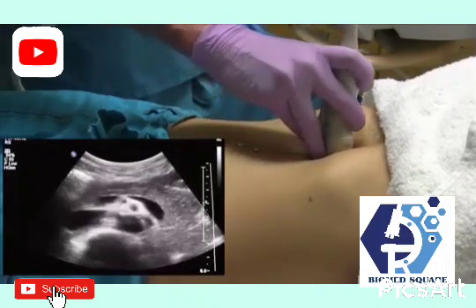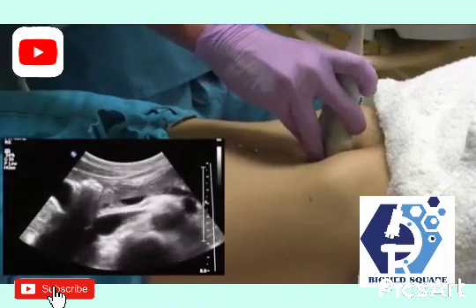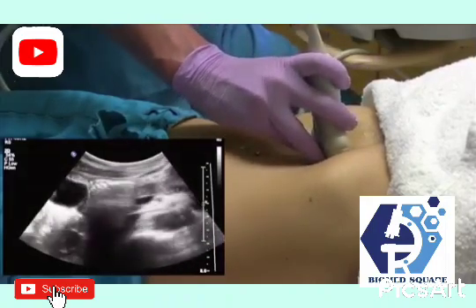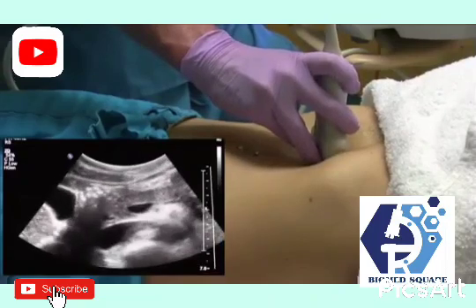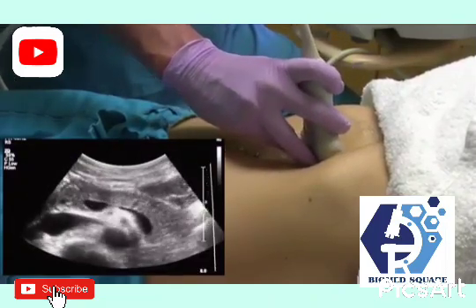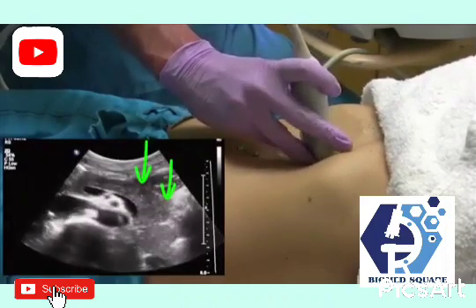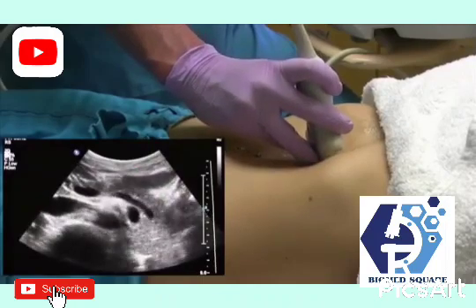And we'll also try to look at the head and uncinate process here, all the way down to the tail of the pancreas. Most patients, you probably won't be able to see the entire tail of the pancreas, just because it kind of dives deep from this position here.